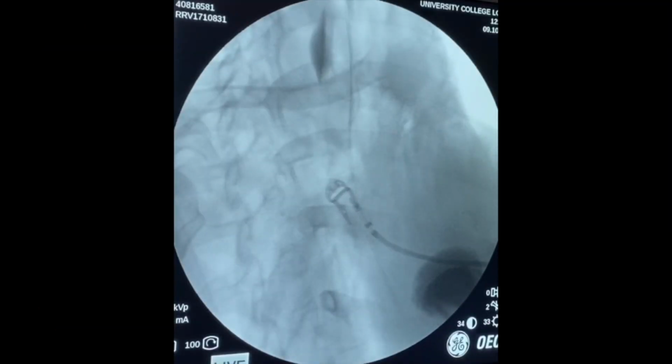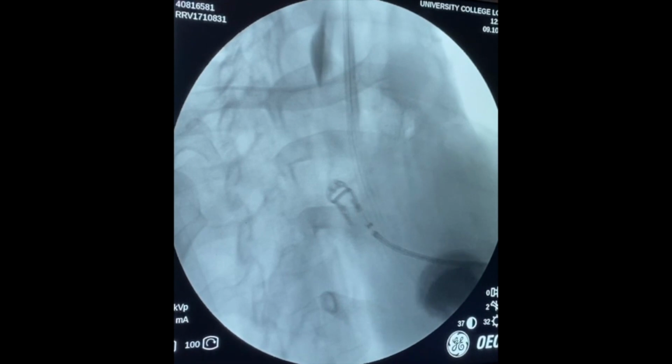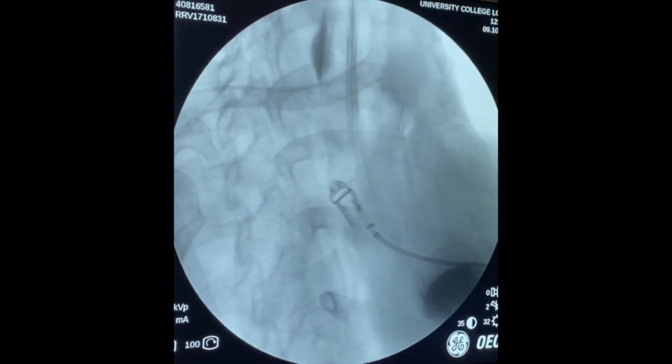I insert the stent over the jag wire, first visualizing the distal markers and then the proximal markers. I can then line these up with my earlier marker from the contrast injection. When I am ready, I can begin deploying the stent.